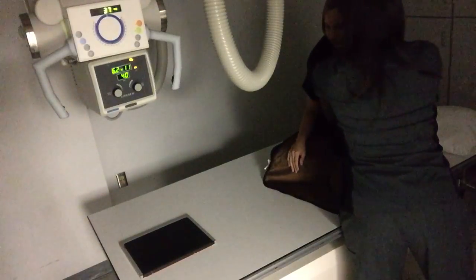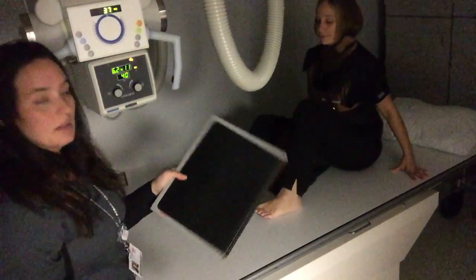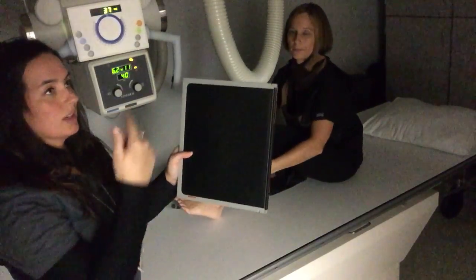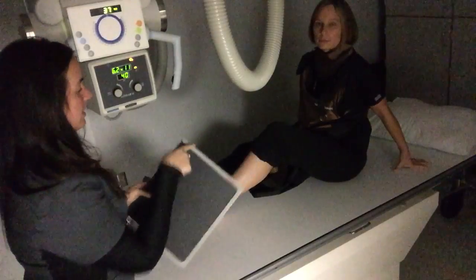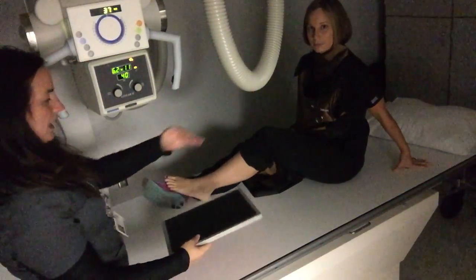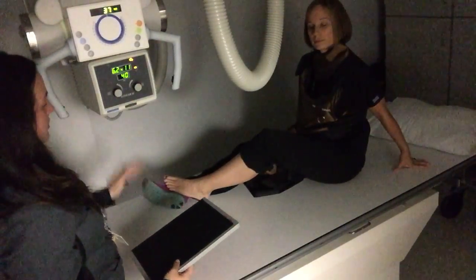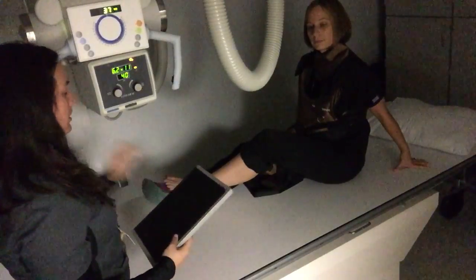And then we're going to have her take off her shoe and sock on the affected side, which we already did. Do this left ankle. We're using a 10 by 12, and once again, we want to put our red line where we want it to load as the top on our CR reader. So this time, I'm going to put the red line towards her knee. That way, when I look at my ankle loading up, my foot will be at the bottom, and the lower part of her leg is going to be here at the top.